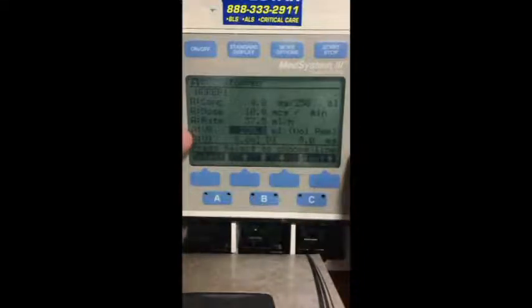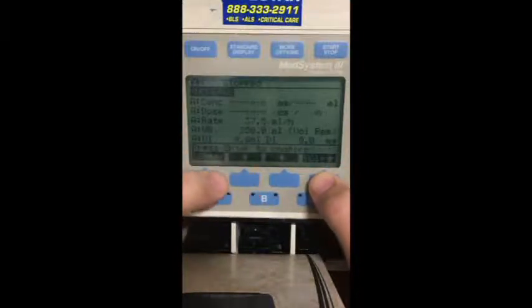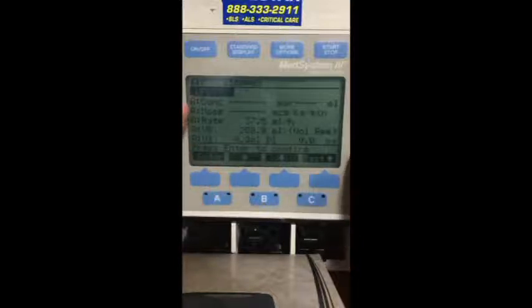Volume remaining in the bag. And then we have our volume that we've already infused and the dose that we've already infused. When you don't have a choice in here and the med's not in there, we can go up to drug. Now this is generic. If it's not a weight-based drug, I don't have to put in a weight base. So I can just skip it.